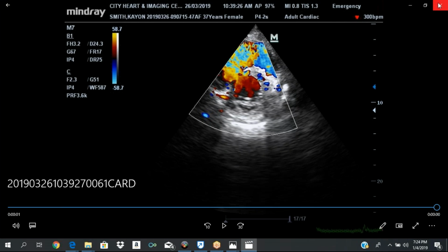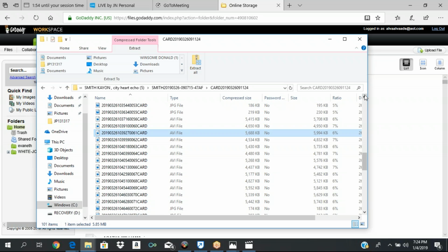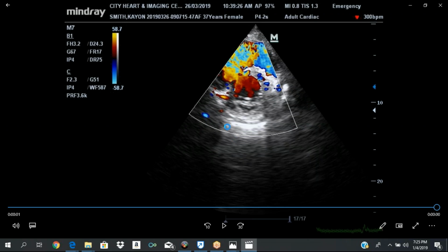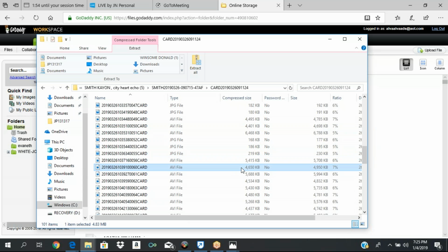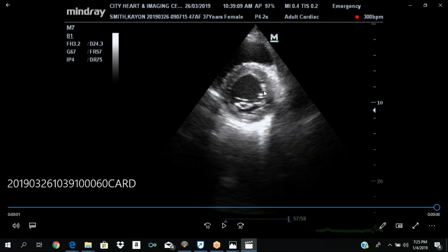So to move from your parasternal short axis at the level of the aorta to the base, you just move the angle of the transducer upwards. You're going to move the angle of the transducer a little bit upwards. And at the base, you're supposed to say the mitral valve. Okay? So from your aortic position, you're going to move the angle of the transducer up a little bit. And the base, that's where you have the mitral valve. Okay? So this is short axis at the base.